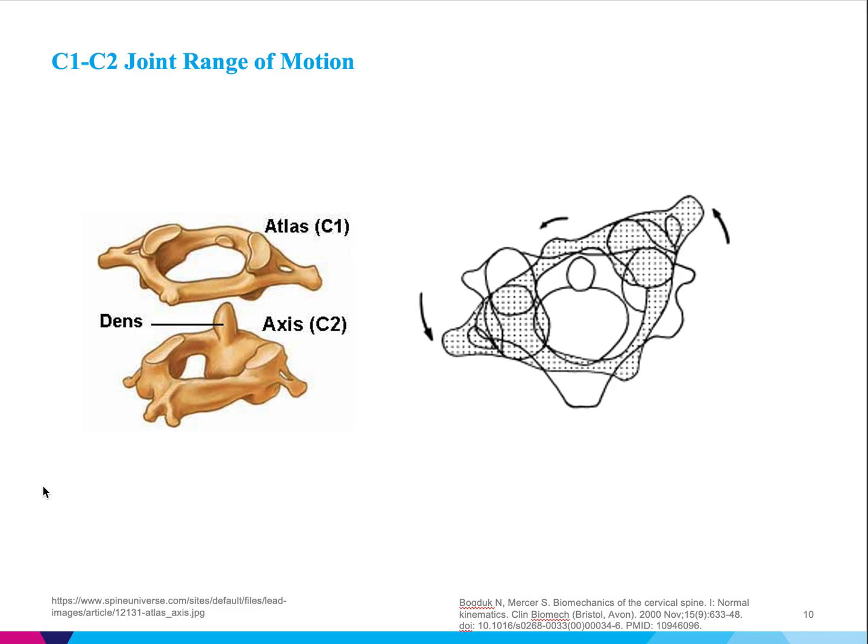And if you look at the entire cervical spine, roughly C1-C2 accounts for 50% of the axial rotation of the neck. So you can imagine anytime we do a C1-C2 fusion or fix these two vertebrae with hardware, we are taking away 50% of the axial rotation. And this loss of rotation is more than at any other level in the spine. So if there was a good solution where we could preserve motion, even a fraction of the motion, it would be a welcome tool to have in our tool bag.